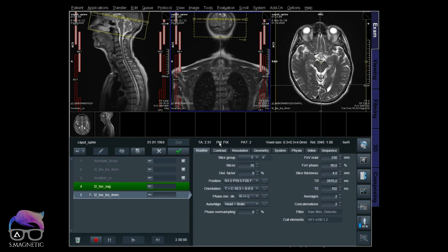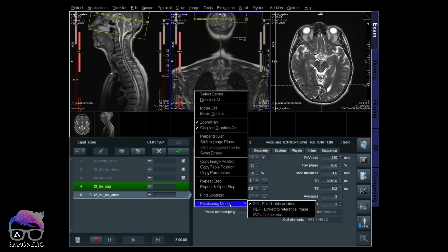You see the corner with the blue line - that means that window is active. Even though this localizer for the cervical spine is active, the head sequence T2 weighted positioned in fixed mode will stay there. It will not move - it stays at the head.